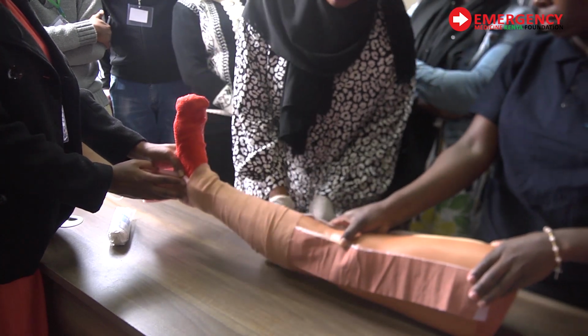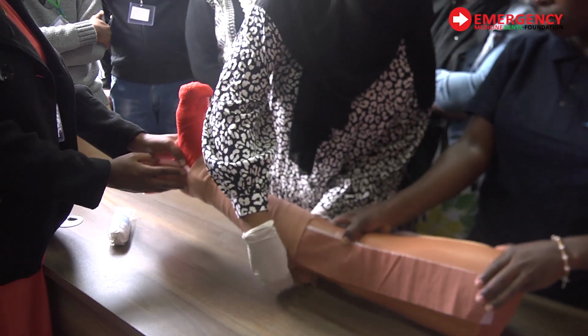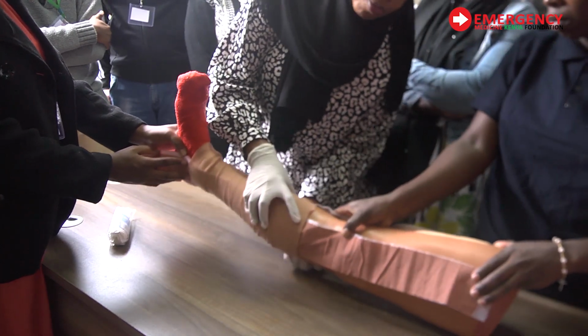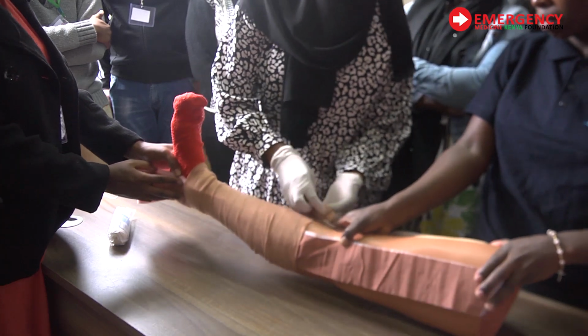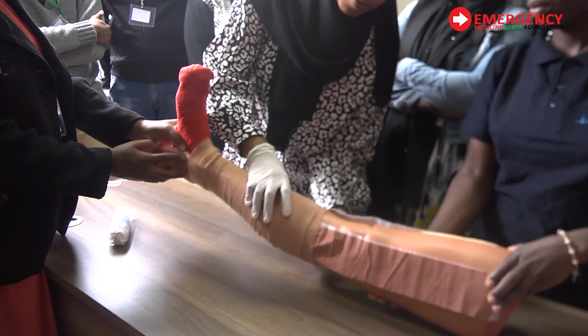So you just make sure you put a bit of tension, okay? But not too tight that you get compartment syndrome, okay? So it should be firm so that it can play the role of what it's supposed to do, okay? So you can go around it, you can go even above the knee.